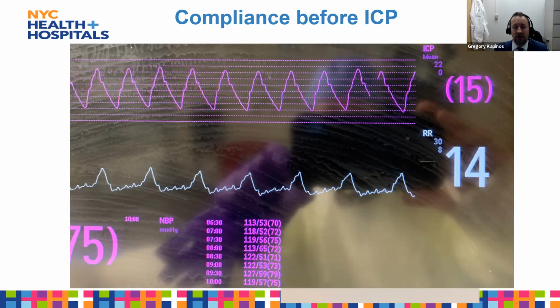And then that big bump that you see on top, the peak, is actually the P2. And then we see also the P3 on the slope down has a little notch there. So there's actually 2 notches. On the way up, a notch that tells you that the P1 is low and the P2 is super high, twice the height of the P1, and the P3 is also higher than the P1.